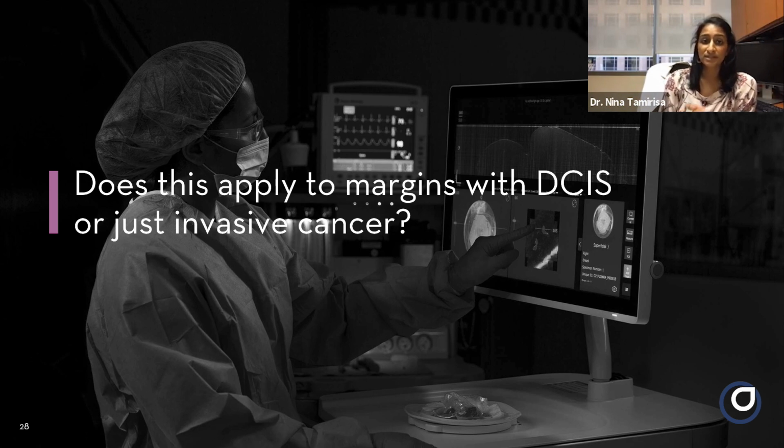So it helps patients understand that you're really trying to understand the margins at the time of the surgery, and it sets that expectation for them as well. So those are cases in which it can be quite helpful too.